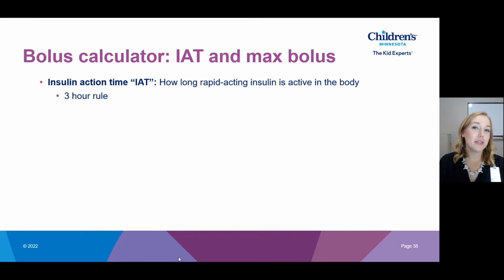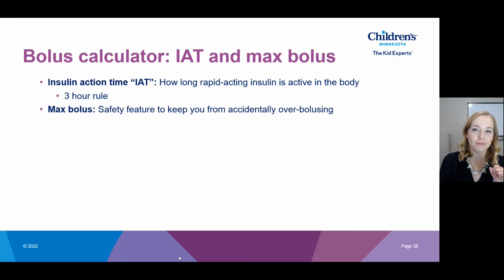What's nice on a pump is we program this insulin action time so that if you do want to give a correction bolus early within those 3 hours, it is keeping track of how much insulin is still on board. It's still active in your body, and it will subtract that from your blood sugar correction so that you don't get overcorrected. So it's a pretty cool feature.